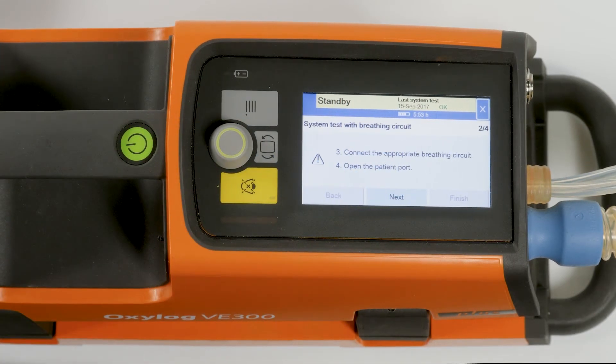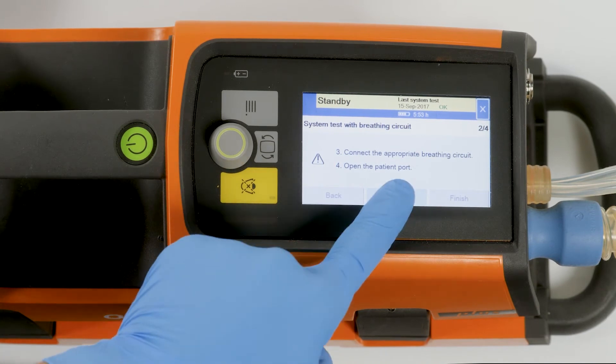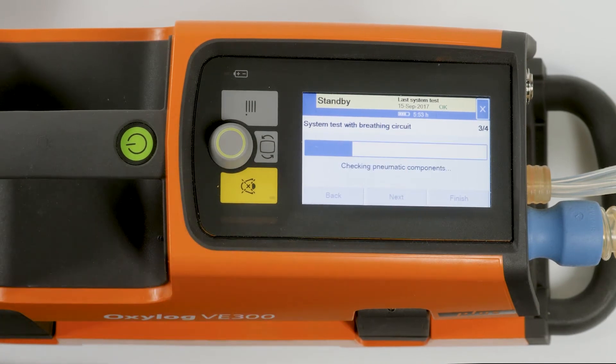On screen two out of four, confirm the advisory message with the next button. The system test is then started. Its progress is indicated by a bar on screen three out of four.